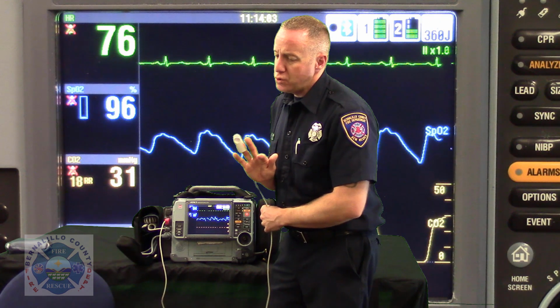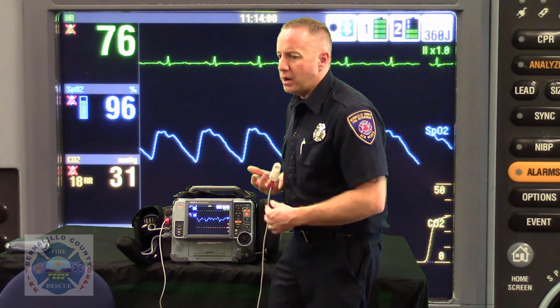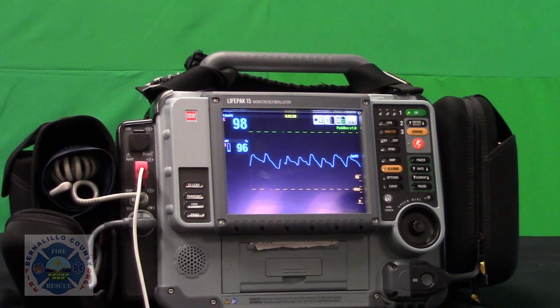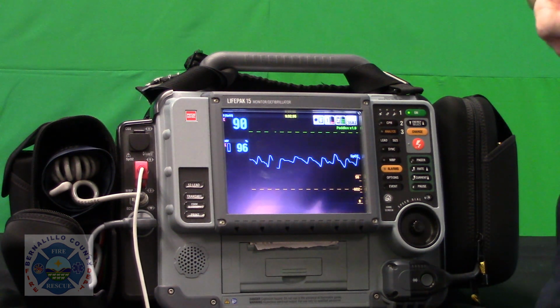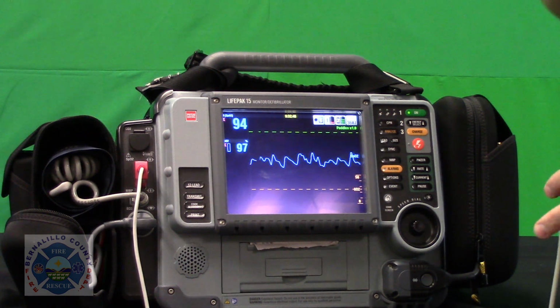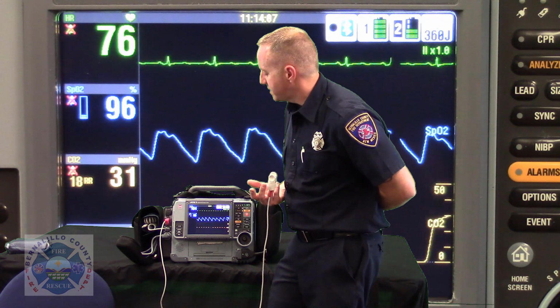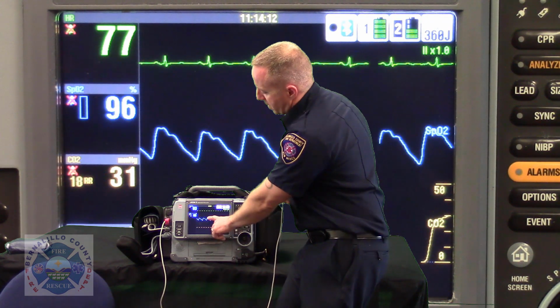So the SpO2 cable in this configuration is doing something beyond that. This is actually letting me know that I have heart pumping activity. Does that make sense? So by putting up the plethysmograph here along channel 2, it's subject to patient movement and artifact, but do you see that nice tall waveform and it corresponds with the heart rate? And what's fascinating about this is that you could even argue the difference between systole and diastole just by looking at this waveform, because you'll see how it sort of peaks, bumps off, and then goes down again.